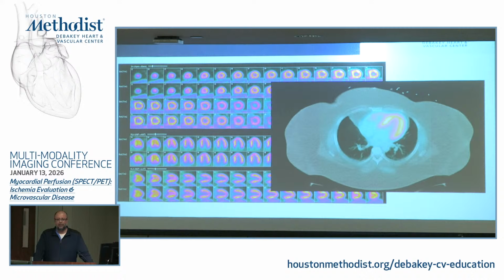So the image quality, if you do it right and you do your injection right, then you are able to get consistently high quality images irrespective of the BMI and irrespective of the generator.